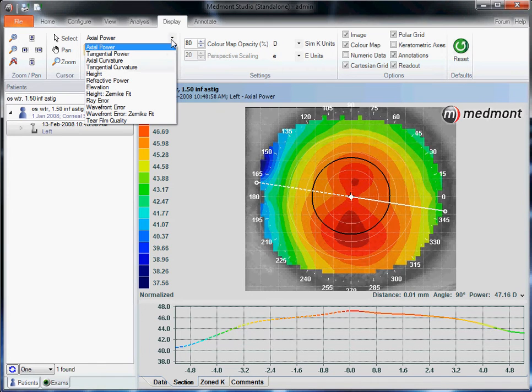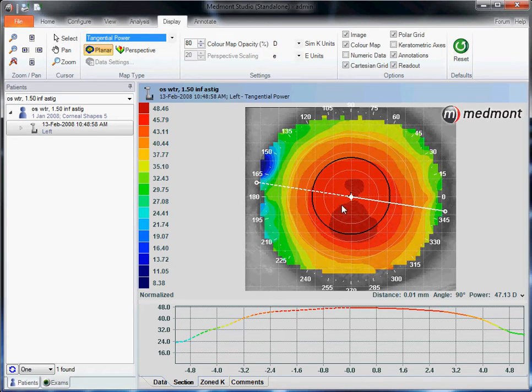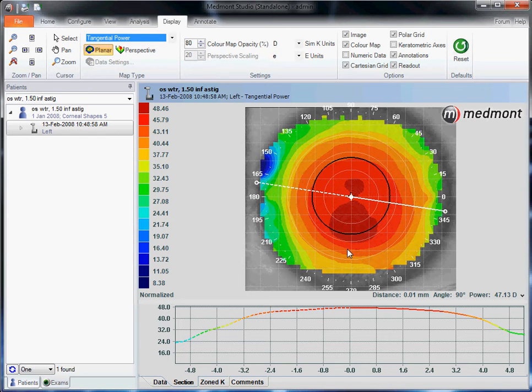The next option on the list is tangential power. Tangential is to understand the shape of the eye. In this case, we can see all the color contours appear to be pulled or stretched inferior or slightly temporal. The hottest contour appears to be pulled below the pupil, and the next red contour is pulled inferior temporal as well. So if we were to place a rigid contact lens on this patient's eye, we would expect that lens to position slightly inferior and slightly temporal of the visual axis or pupil.